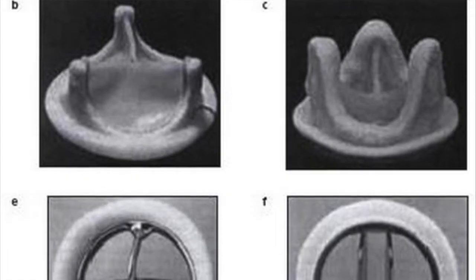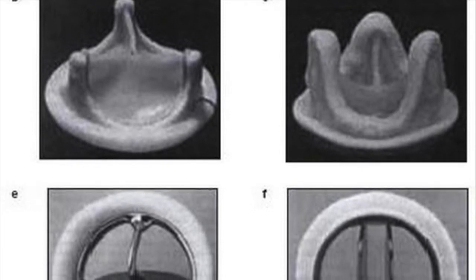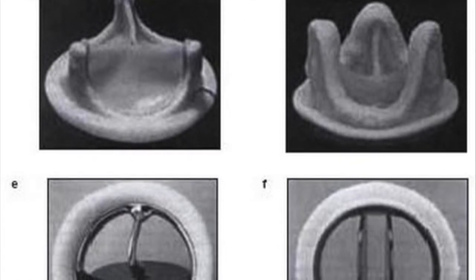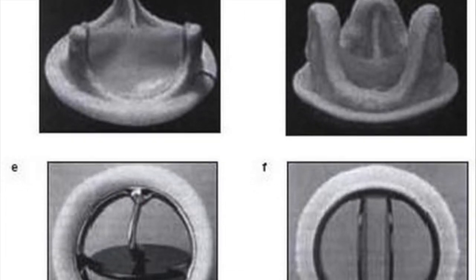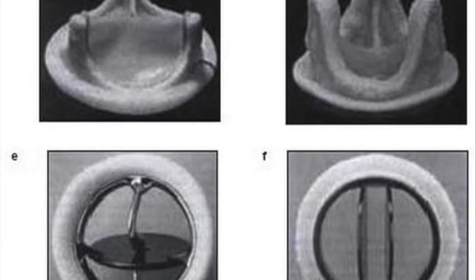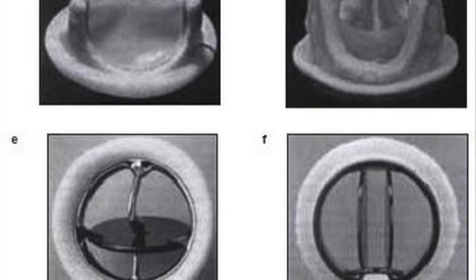There are two main options for a heart valve replacement, tissue or mechanical. A tissue heart valve is produced using an animal donor's tissue, such as a cow's or a pig's. Tissue heart valves are usually less prone to blood clotting, and therefore require less medication for blood thinning. However, they typically last only 10 to 20 years before needing replacement, whereas mechanical heart valves typically last for the rest of the patient's life. This trade-off means each heart valve has its place in certain situations.